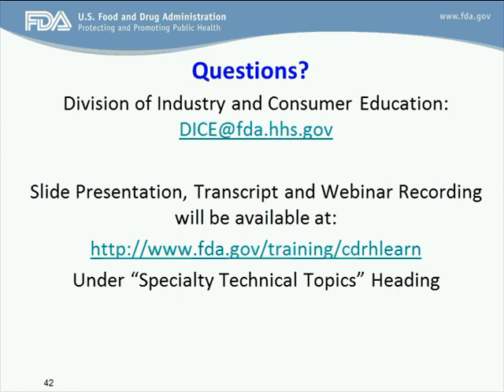I mean, you asked a question, I believe, like cleaning method 1 with a certain sterilization method. So if that is what you're recommending in your labeling, that needs to be validated. Sorry, it's not clear to me. If we're recommending 6 different cleaners and 3 different sterilization methods, and we test each one independently, that's sufficient?